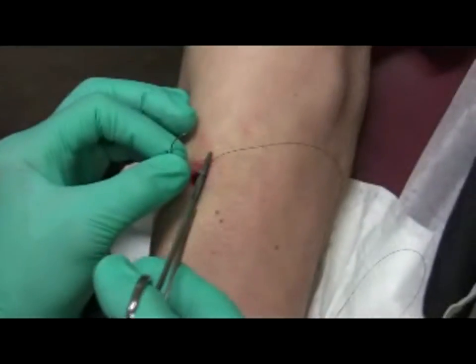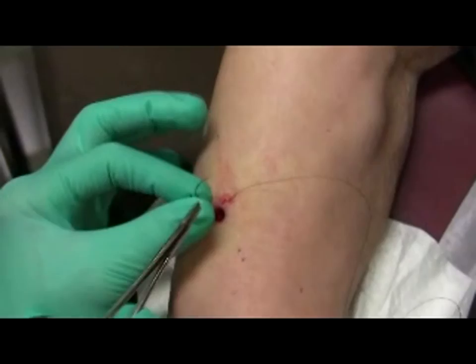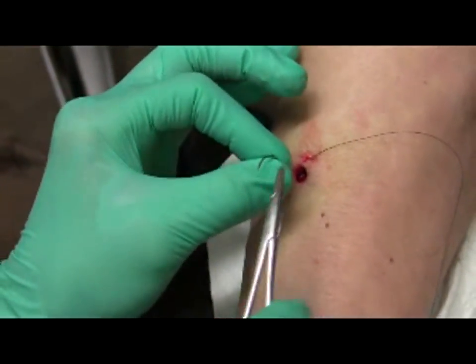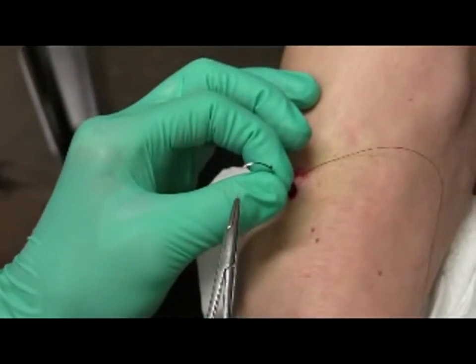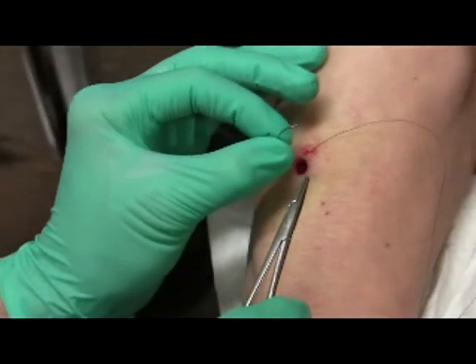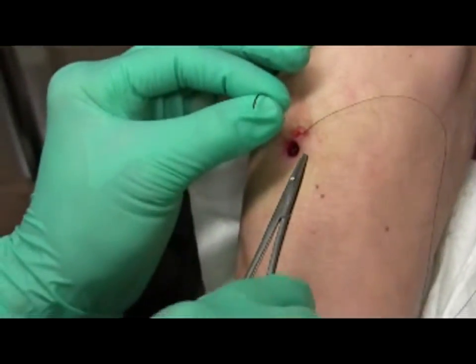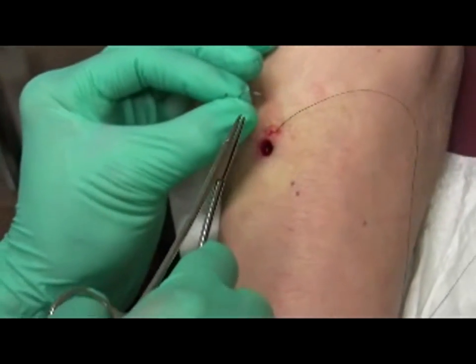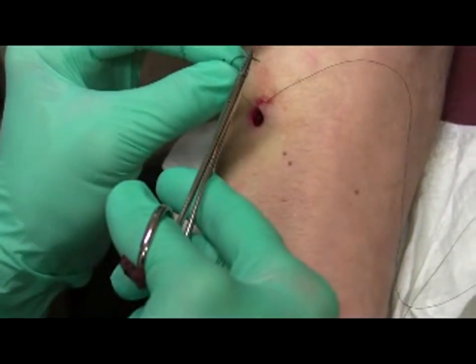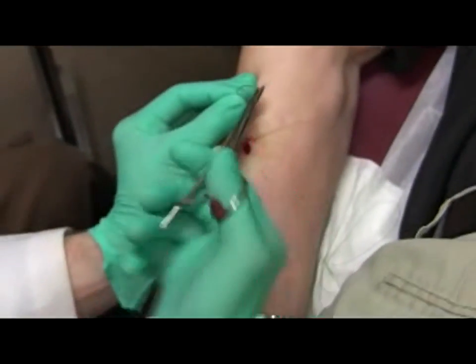Grab the suture at the base of the needle with the needle point pointing away from your fingertips, i.e. in the same direction as your fingertips. If the needle is pointing toward you or toward your fingers, you're going to get stuck. Avoid letting the needle turn perpendicular to your fingers, or worse, toward your fingers. Then release the needle point from the needle driver, load the needle between your fingers, twist your wrist back, and load the needle driver again — now you're ready for the next natural stroke.